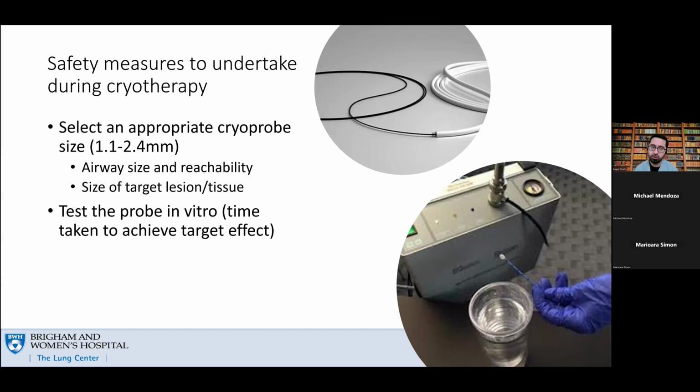And two, just this exercise will remind you of the need to be careful and not do it for a longer period of time, particularly when you're going to be doing cryoadhesion, because you don't want to freeze a bit of normal airway wall and then start yanking it up.